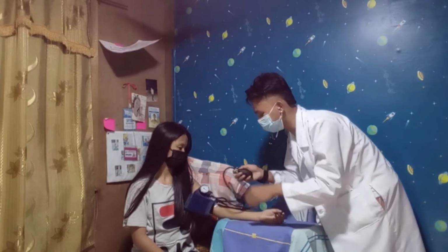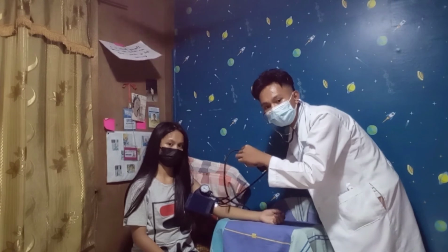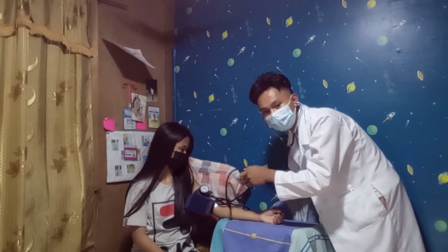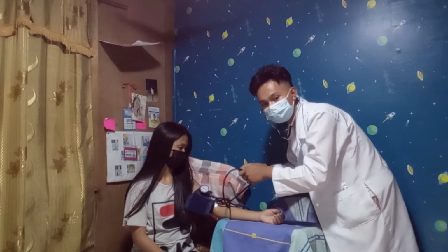Close the pressure valve clockwise until it is tight. Quickly inflate the cuff until the last sound, then add 30 mmHg.